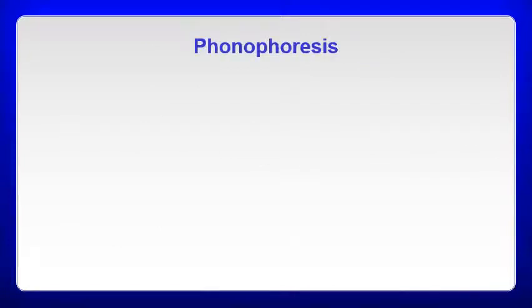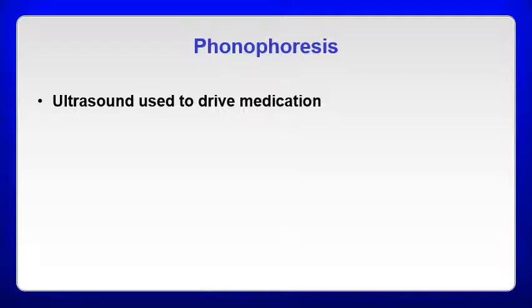Phonophoresis is a way of utilizing ultrasound. The idea is to drive medication through the body. So this is where you will actually take a medication, and you have to use specifically prepared medications for this. Way back when, we thought that we could just take over-the-counter hydrocortisone cream, because hydrocortisone is one of the medications that we'll use for phonophoresis, the cream you would use over skin rashes and stuff like that, and utilize that as an anti-inflammatory.